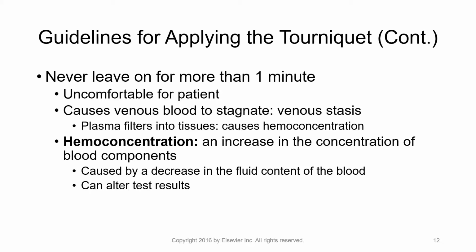Hemoconcentration: an increase in the concentration of blood components due to extravasation because of venous stasis. This is caused by, again, a decrease in fluid content of the blood, and it will alter test results.